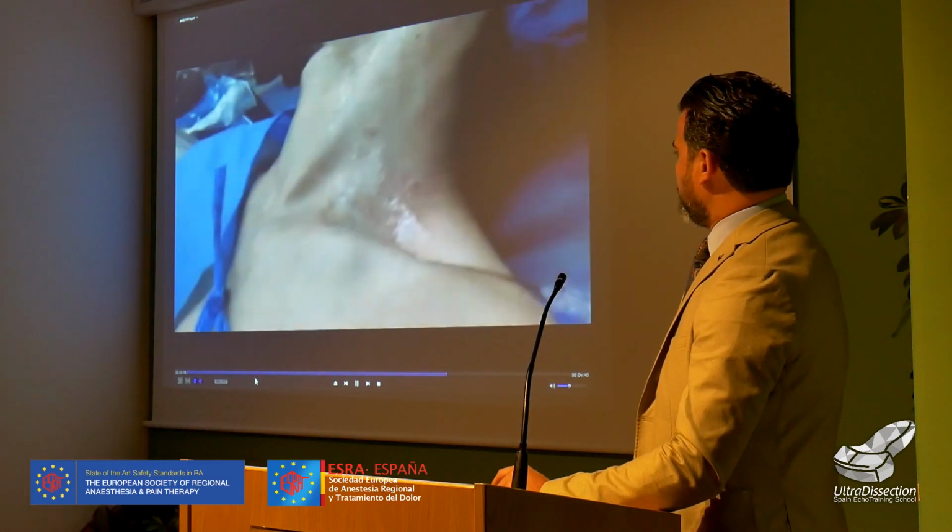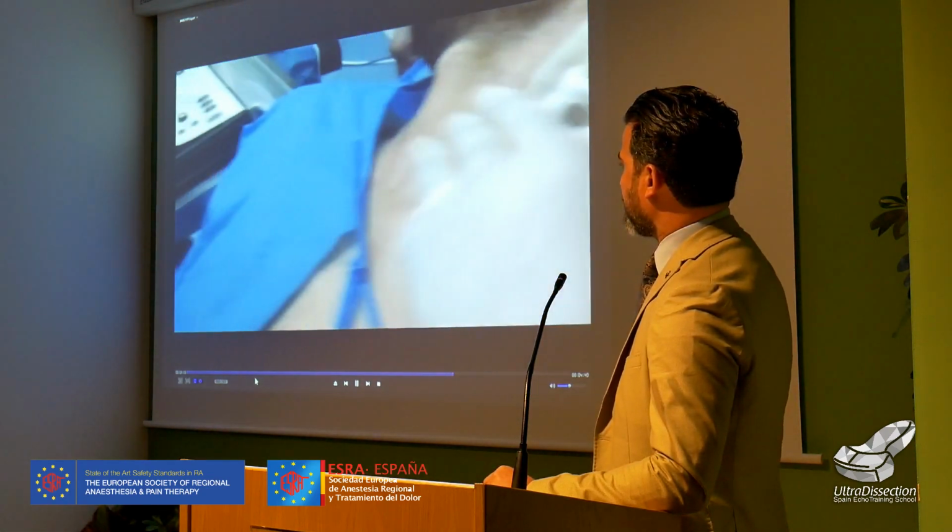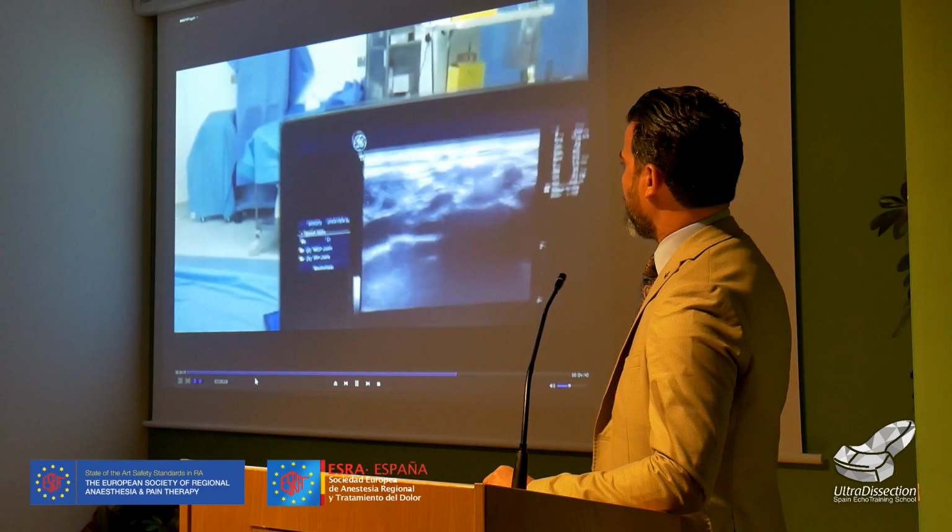See, here on the supraclavicular area. Okay, now I will show you how to stimulate the T1, T2.